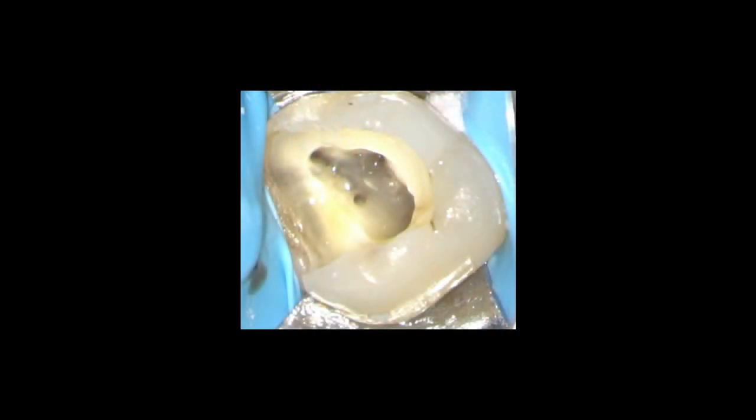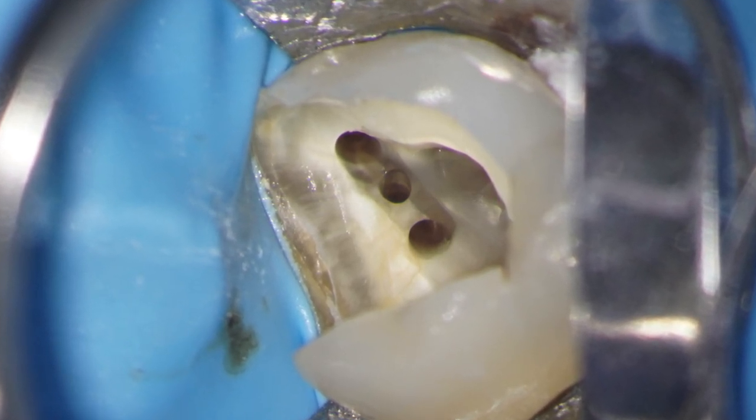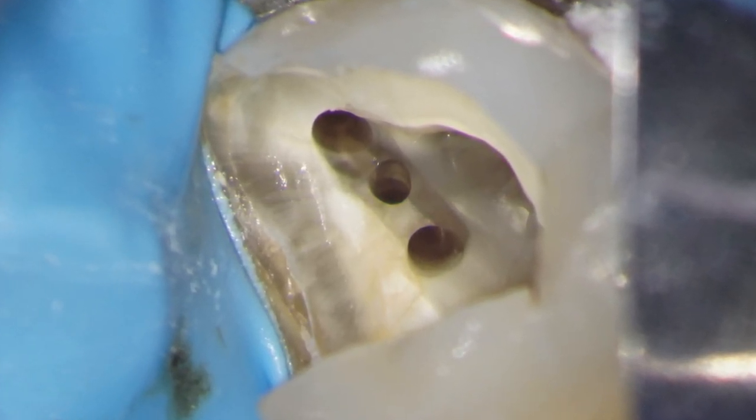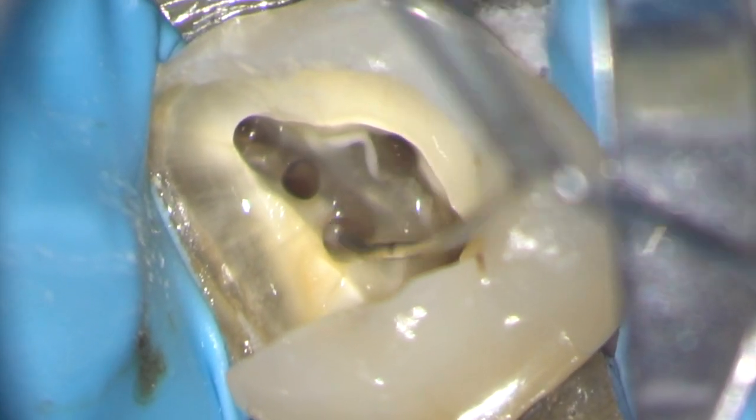I think I'm all done and I take a quick scout of the pulp floor using high magnification. I can see the MB1, the MB2, the distabuccal, and palatal. But what's this - could it be an MB3? Yes, it turned out to be an MB3 and I prepared it in exactly the same way as the MB2. When I'm drawing back on the irrigating syringe, you can see that the MB2 and MB3 are converging. The MB1 is a separate canal.